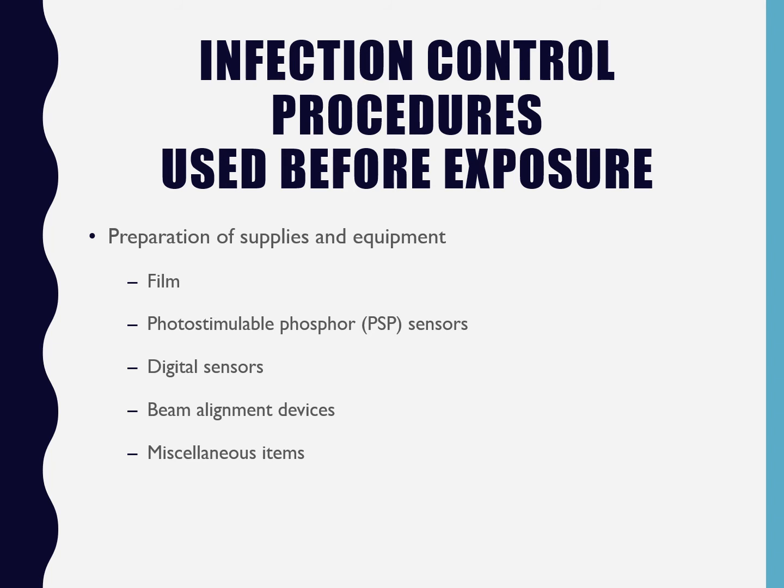And if they have any bobby pins or things like that in their hair, they have to take that out for the panoramic, but not for intraoral x-rays. Anyway, if they have their purse in the way of you being able to walk around the patient, that's something they need to move. If they're wearing a really bulky coat and you're not able to put the lead apron on over that, they need to take that off. So you just let your patient know exactly what kind of x-ray we're going to be taking, and you prep them ahead of time so that they can be ready to take those radiographs.